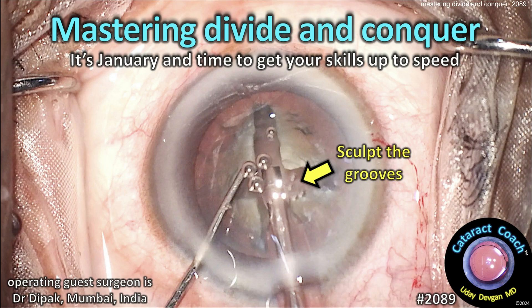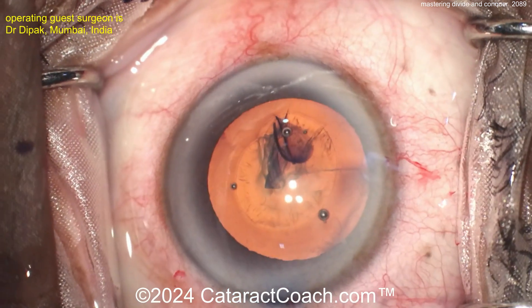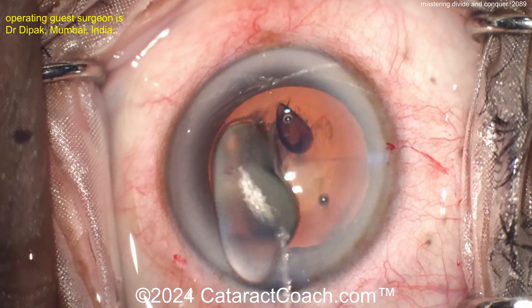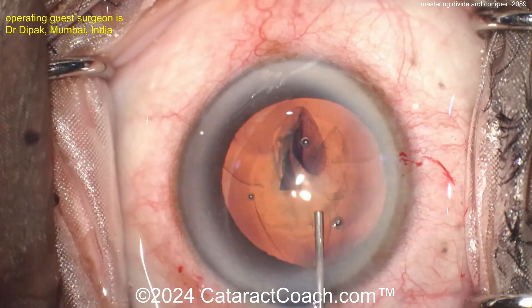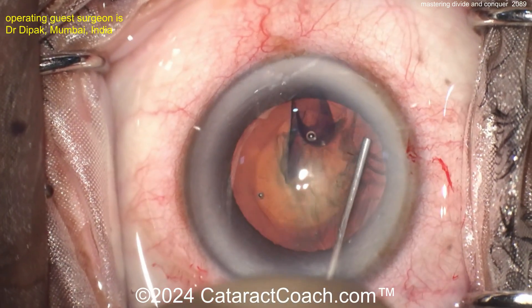Cataractcoach.com — mastering divide and conquer. It's January and it's time to get your skills up to speed. Here's a beautiful case of divide and conquer. Let's look at this case in detail. It's important to have a good capsulorhexis, because you're going to be dividing this nucleus into pieces, putting some stress on the capsular bag. If you have a run-out, you can get it zipping around to the posterior capsule and be in trouble.